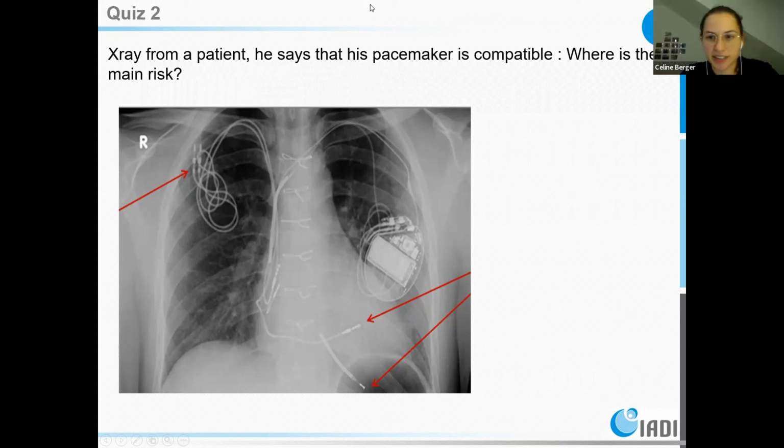So there was an answer in the chat. I can read it. Colette wrote that coils of wire are equal to the conduction loops plus the electric interference. Perfect. I didn't understand exactly what you mentioned, but it was more or less this. Of course, you have some loops here. This is dangerous for the radio frequency.